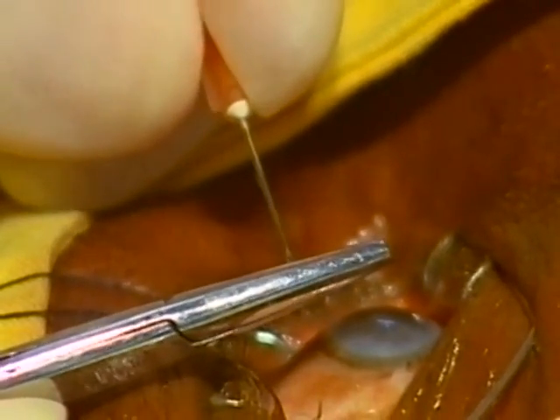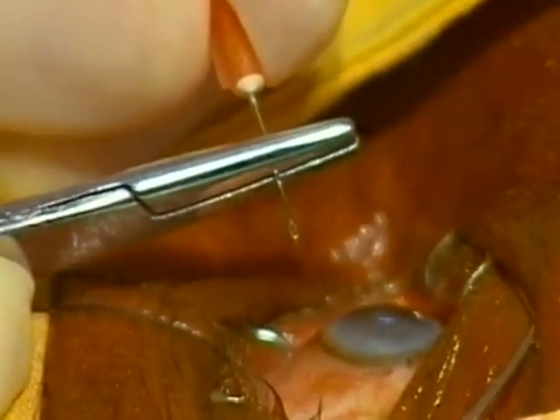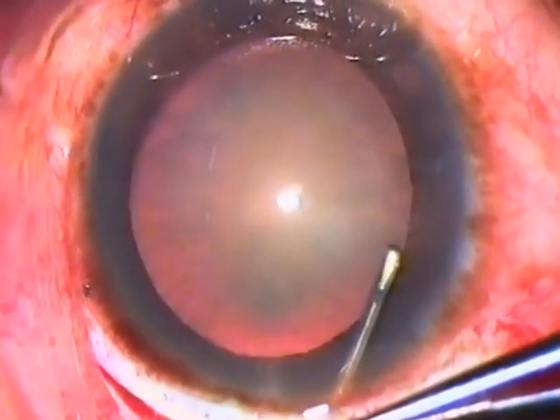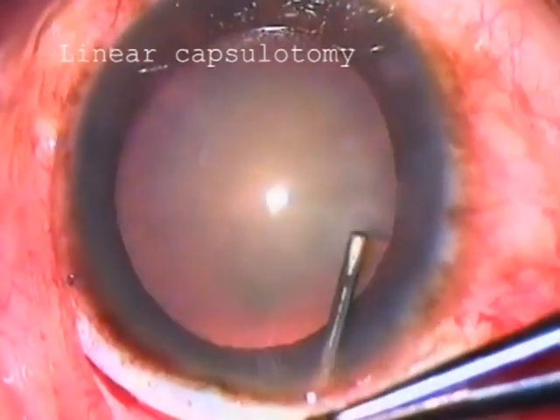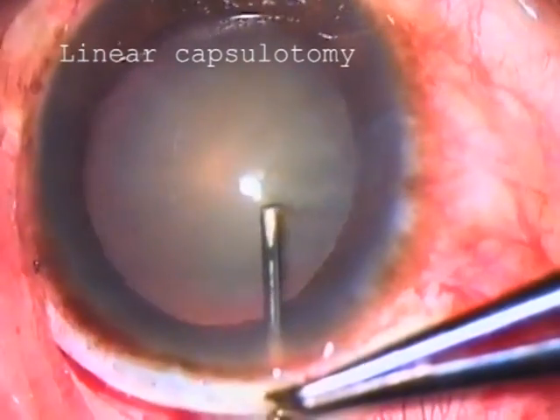A 25-gauge needle can be bent to make a cheap and effective cystitome. Using this needle, a series of small cuts are made in the anterior capsule from 10 o'clock to 2 o'clock. This is called linear capsulotomy.